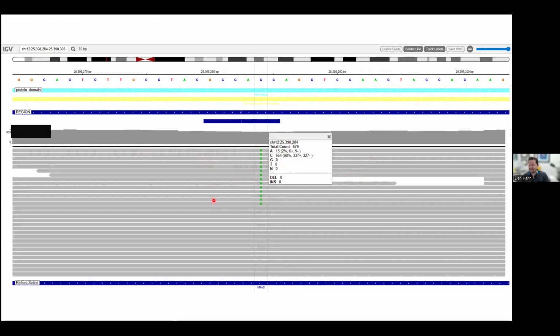Wherever it matches the reference genome, there is no colored base. Wherever it's different than the reference genome, we have a colored base, and it will show how it's different. So in 15 instances, this was A, which corresponds to KRAS G12V, which is very important in treating colorectal carcinoma. But as you can see, the allele frequency is 2%. It's lower than our limit of detection.